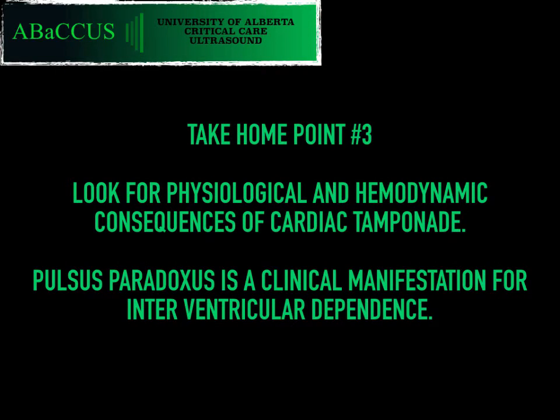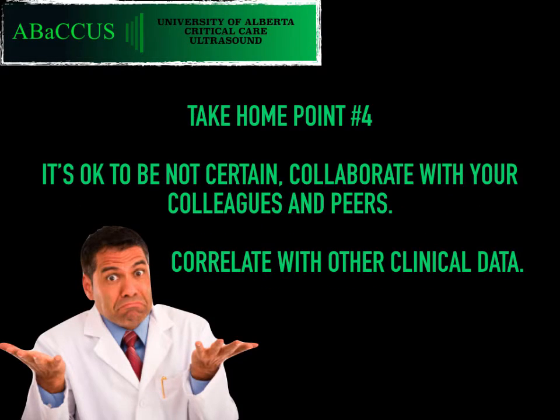Take home point number 3, you can look for the physiological and hemodynamic consequences of cardiac tamponade. Pulsus paradoxus is your clinical equivalent of basically interventricular dependence on echo. And so that is an important finding at the bedside, which you can do quite easily. And it's okay not to be certain. You can collaborate with your colleagues and peers and correlate with other clinical data.